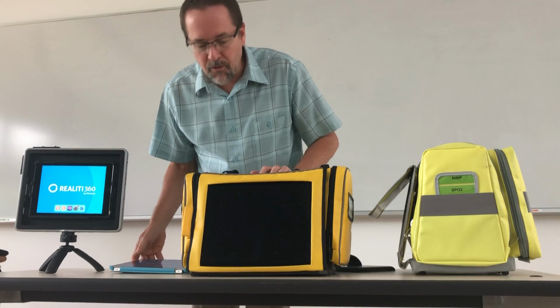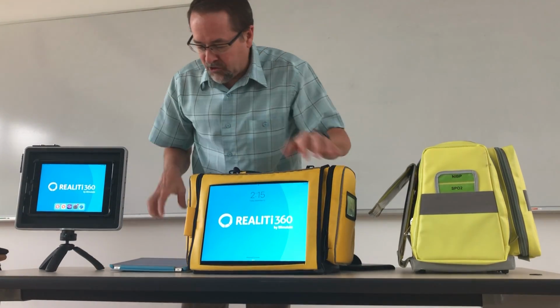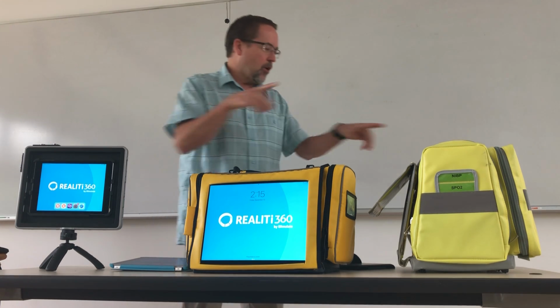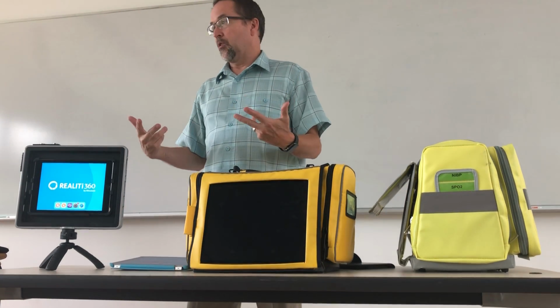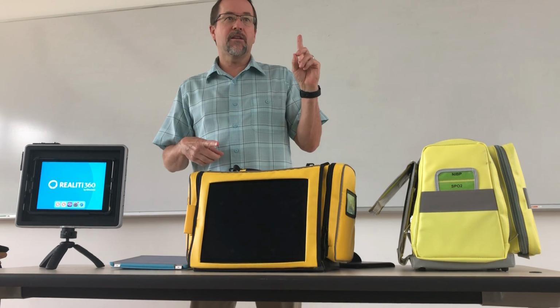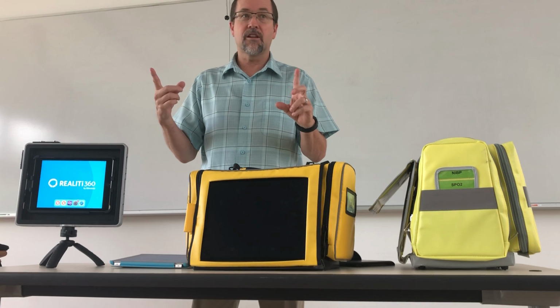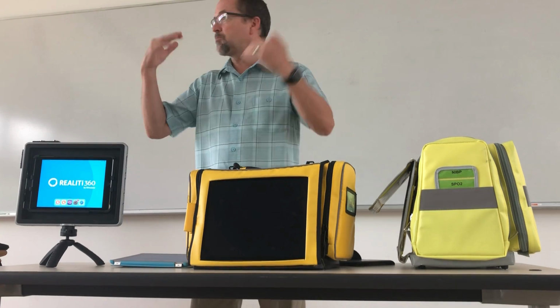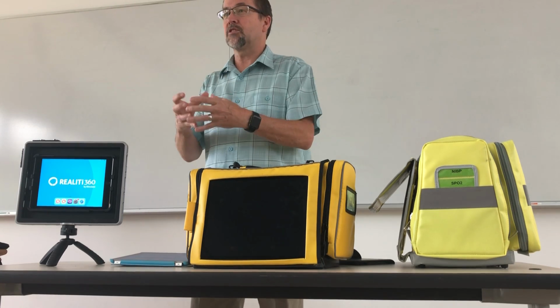So what the system is made up of is the iPads. So you have 3 iPads that are all communicating through that router. They can communicate through any router. You do not want to set them up so they're communicating through your college Wi-Fi, however, especially if it's anything like our college Wi-Fi, because that's problematic because it's competing with a lot of other things, which is why it comes packaged with its own router.